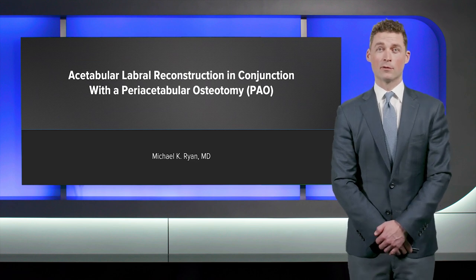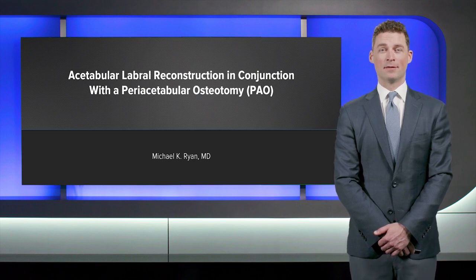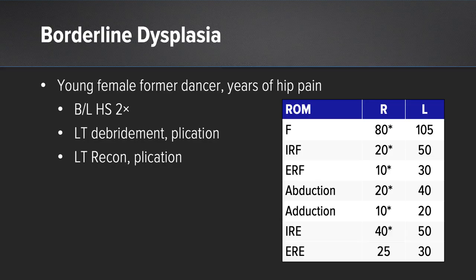Hi, I'm Michael Ryan from the Andrews Sports Medicine and Orthopedic Center in Birmingham, Alabama, here to present a case using the knotless fiber tack in the setting of a labral reconstruction of the hip and a concomitant PAO. This is a female patient, a former dancer, who has bilateral borderline dysplasia and has had years of hip pain.